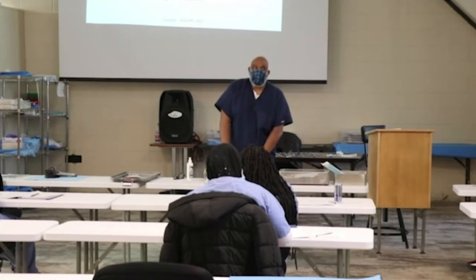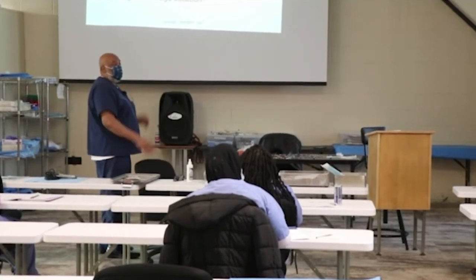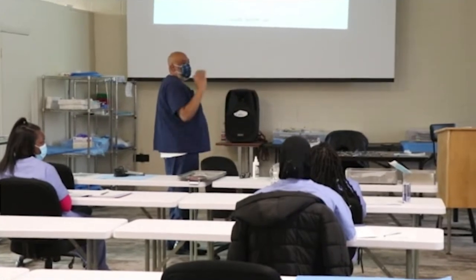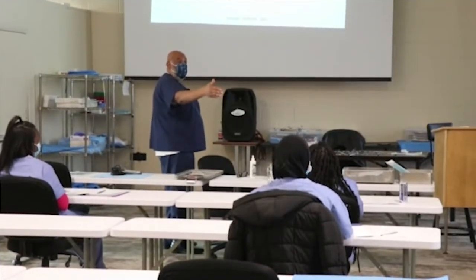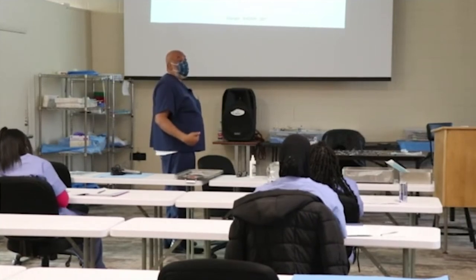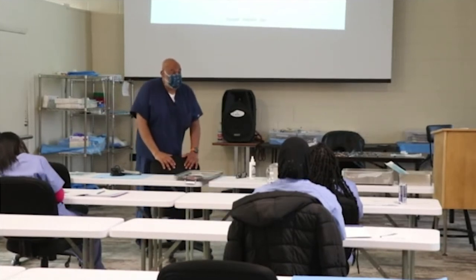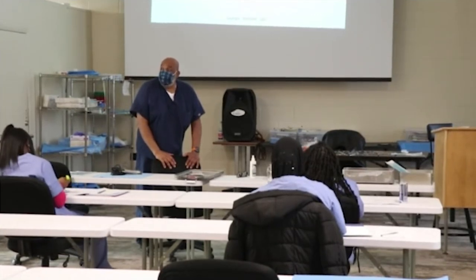Then they go. Our instruments that live in our department, sterile storage, this is where the storage location comes in, because let's look at these different shelves. You got ortho here. You got labor and delivery here. You got neuro here. You got OTO here. You got plastics here, all right? So your job, when you pull the instruments out of the sterilizer and they've cooled properly, is to put them in the right location, okay? Now, because the hospitals have ongoing cases, they're still using instruments that you have need of tomorrow, right, Abby? That's how our priority list continues to generate.